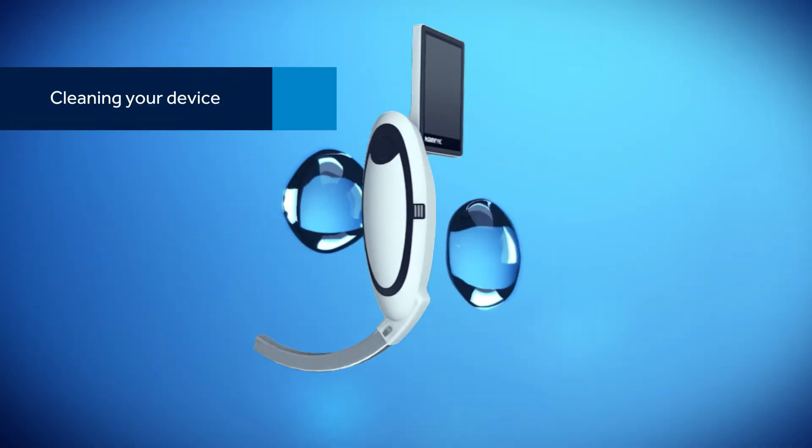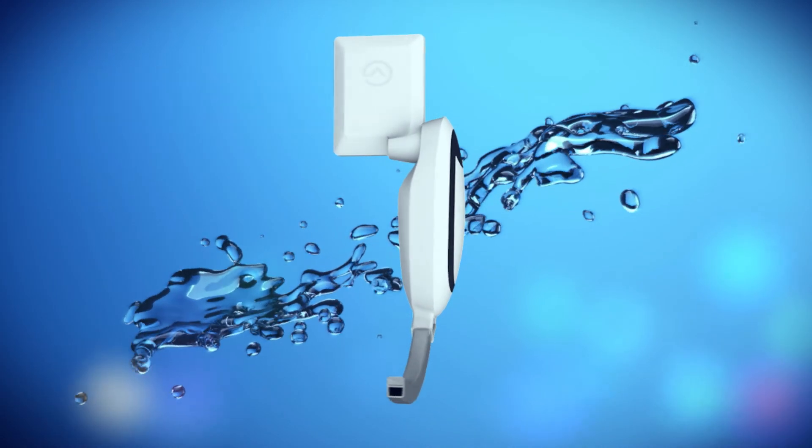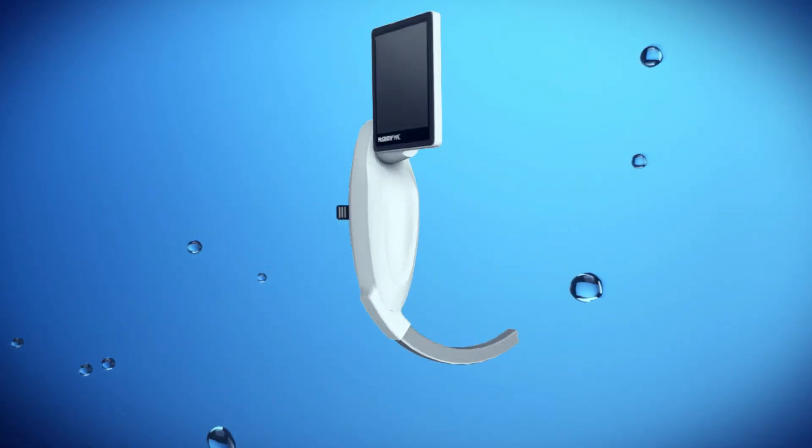The McGrath MAC Video Laryngoscope is high-level disinfectant compatible and has full immersion capabilities, including the screen. For a list of compatible cleaning solutions and proper cleaning techniques, refer to your owner's manual.